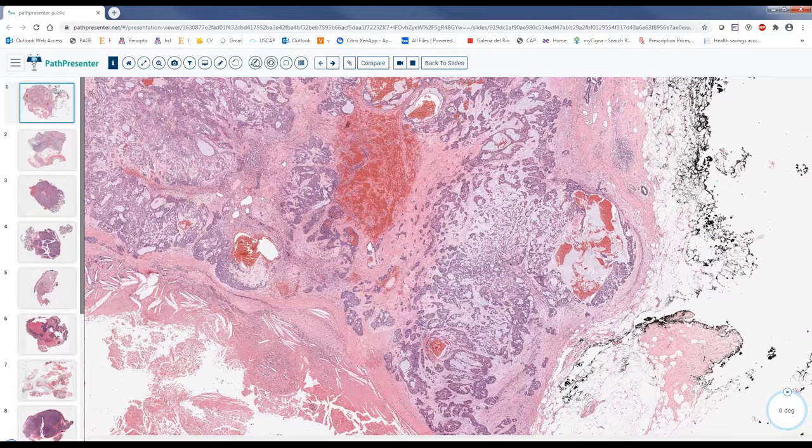I know that some big places like Mass General Hospital, Johns Hopkins, especially Dr. Bill Faquin, he is very interested in molecular testing, and you will find some very nice immunostains being done. PLAG1 can be done by immunostain, but also with FISH, rearrangement can be done as a signature. Okay, and sometimes it's just an academic exercise to do that, but it's good.